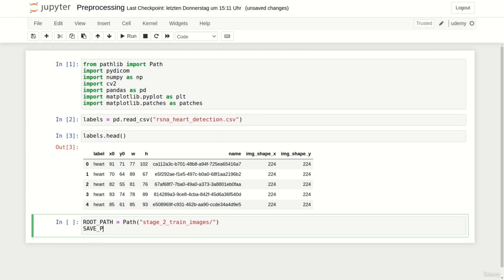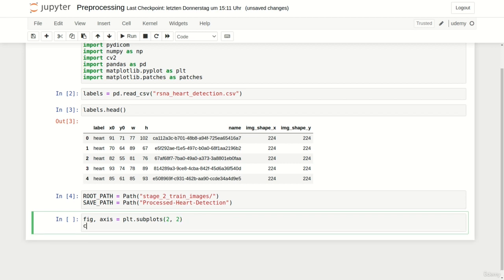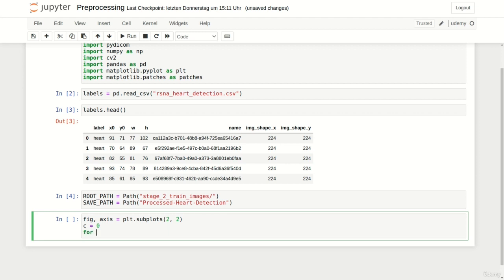Regarding the save path let's define that we want to store the preprocessed images in the directory called processed-heart-detection. Alright it's visualization time. Let's use a 2x2 plt.subplots object to inspect four images. As usual we define our loop counter variable and set it to 0 before creating the double nested for loop.